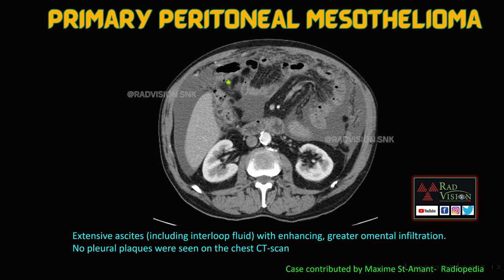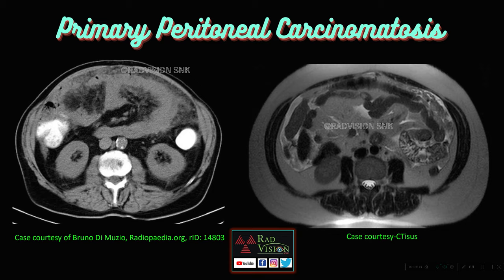In primary peritoneal mesothelioma, there is thickened omentum with infiltration and small bowel loops clustered in the mid-abdomen with ascites. Similarly, peritoneal carcinomatosis shows thickened edematous omentum with nodularity and clustering of bowel loops in the center — both mimicking the cocoon appearance.